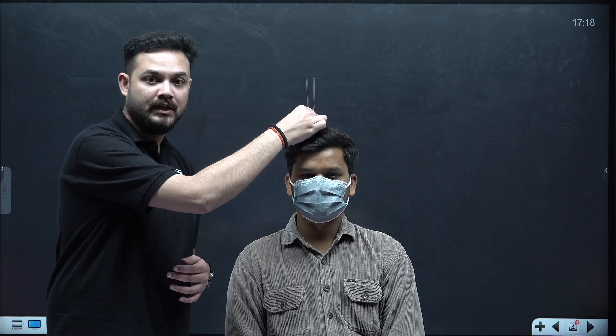After striking, place the footplate over the vertex. However, in Weber's test we generally avoid the vertex if the patient has a very hairy scalp, as hair dampens the sound. Instead, we keep it on the mid part of the forehead. Other acceptable bony midline prominences include the nasal bridge, the upper incisor, or the mentum (chin). We will choose the forehead for this patient.